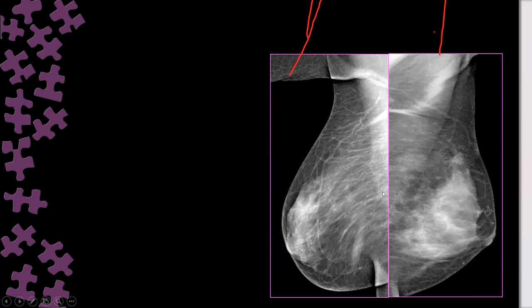breast tissue extending. We are not sure how much it is extending. Okay, because it is not minimal, projecting over the pectoralis, a large amount, and here we even have cancer. But for the right one, the pectoralis is not seen.